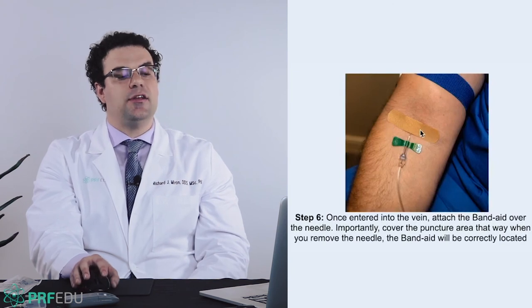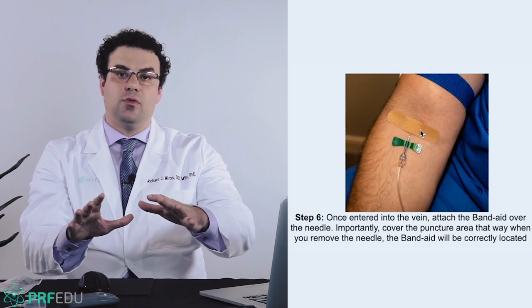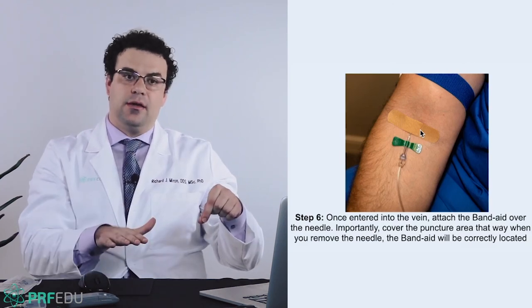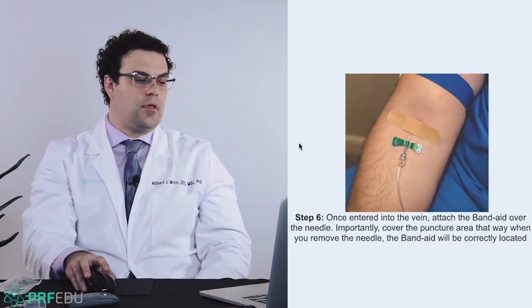And make sure the Band-Aid is over the puncture site, not over the butterfly, but really covering the wound. The reason why you want that is because when the butterfly comes out, okay, Band-Aid is going to go down. You want to make sure the Band-Aid is already in the right location.